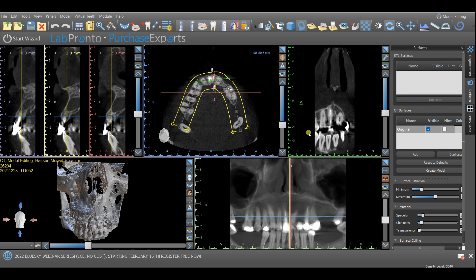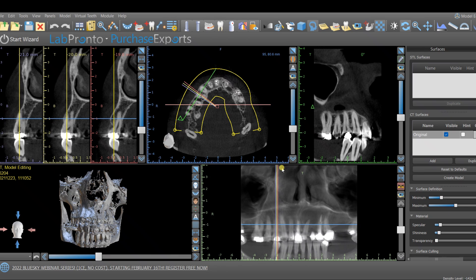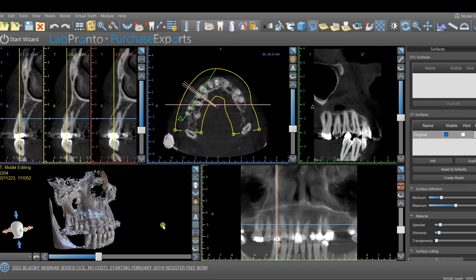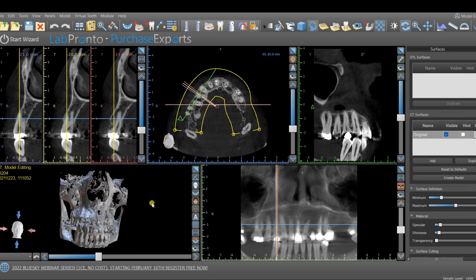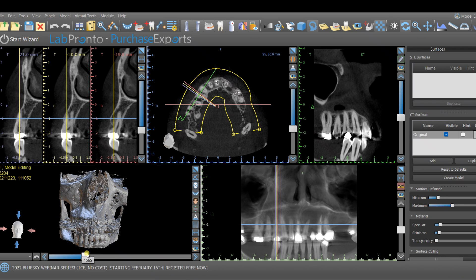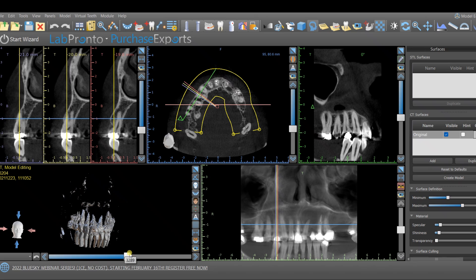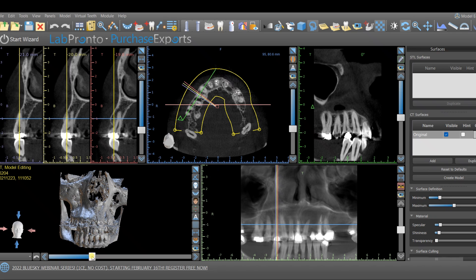I'm going to use Blue Sky Plan — the program will automatically open any DICOM files, since in all CT scans the files are in DICOM format. I will start with the 3D view, which is self-explanatory. Here we have a density threshold: the more density threshold, you will only see denser anatomy; the less dense anatomy will disappear. With less density threshold, we will see more anatomy.